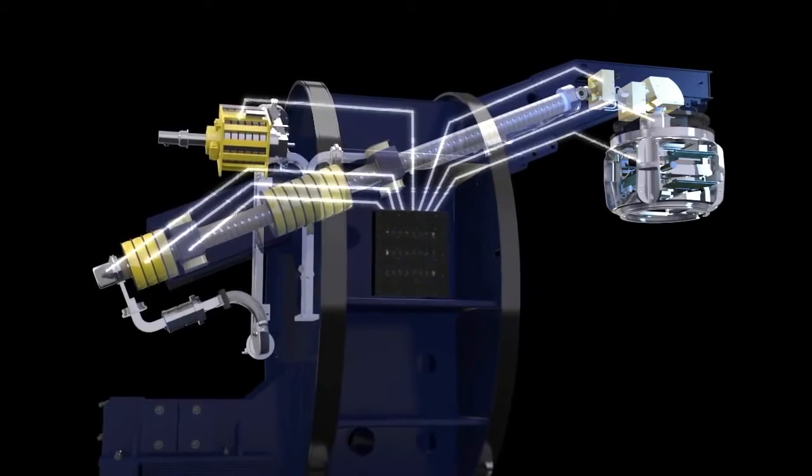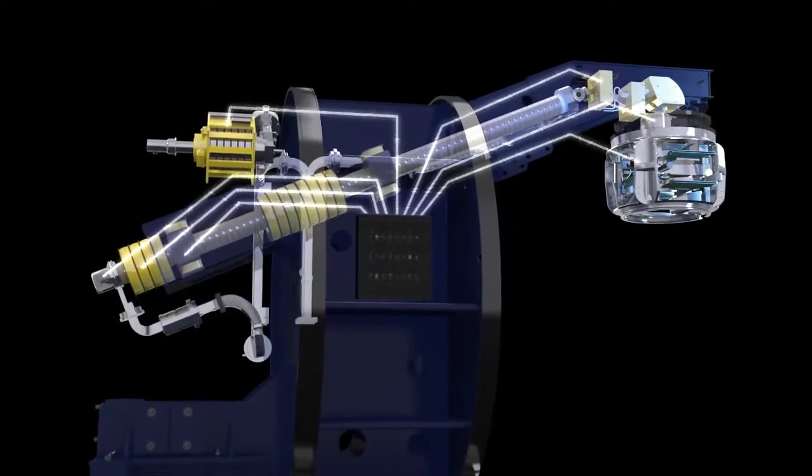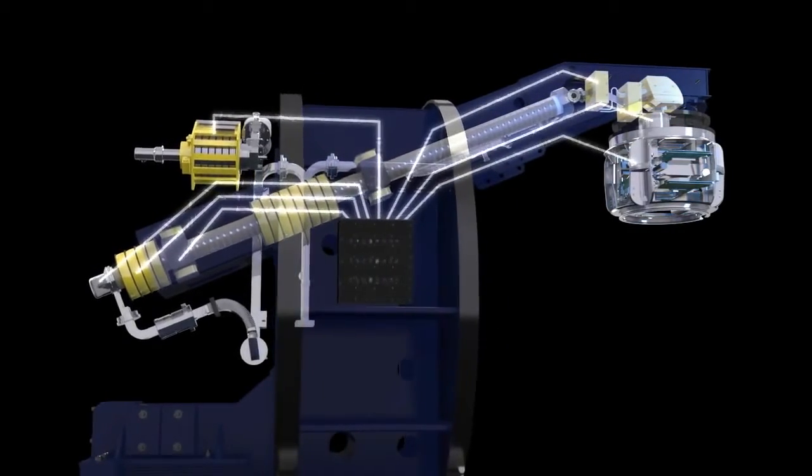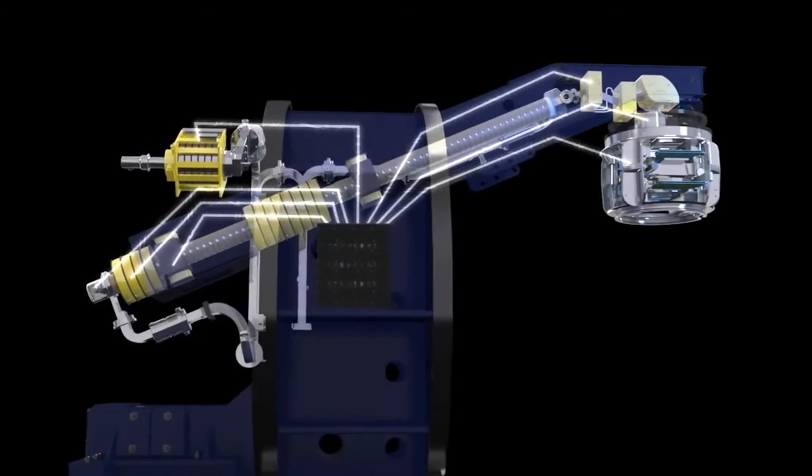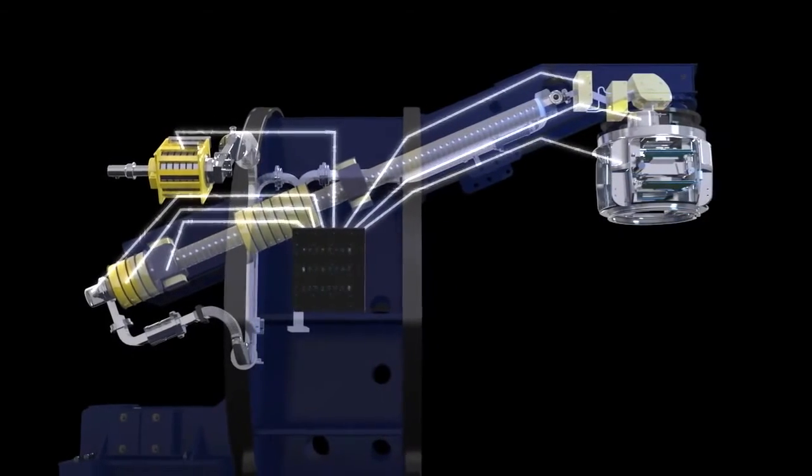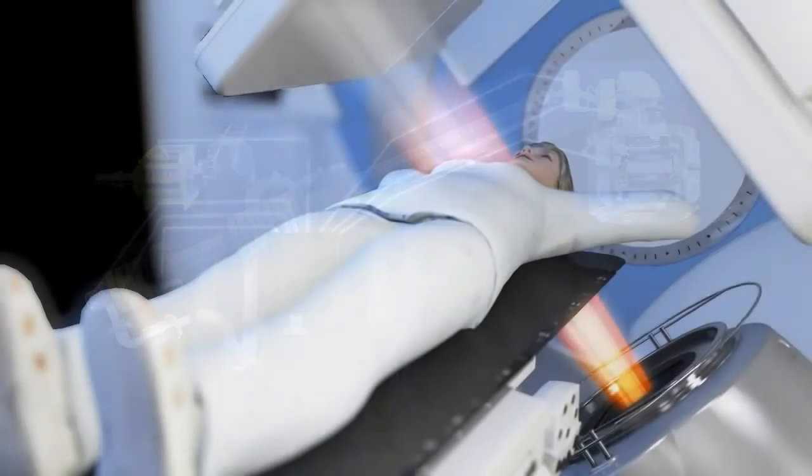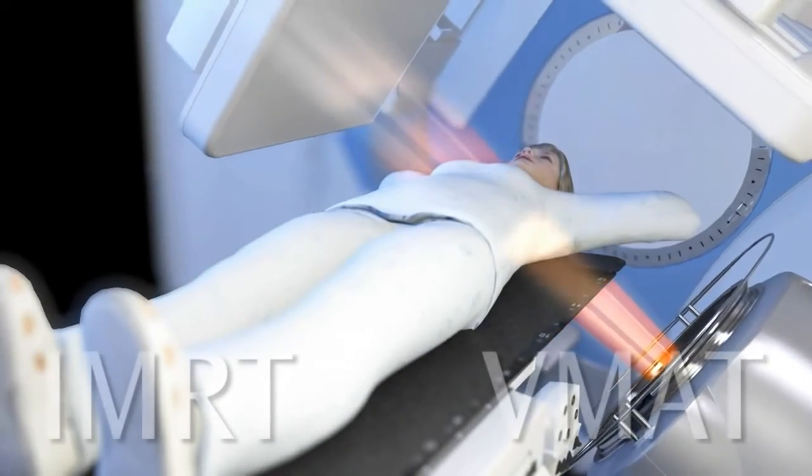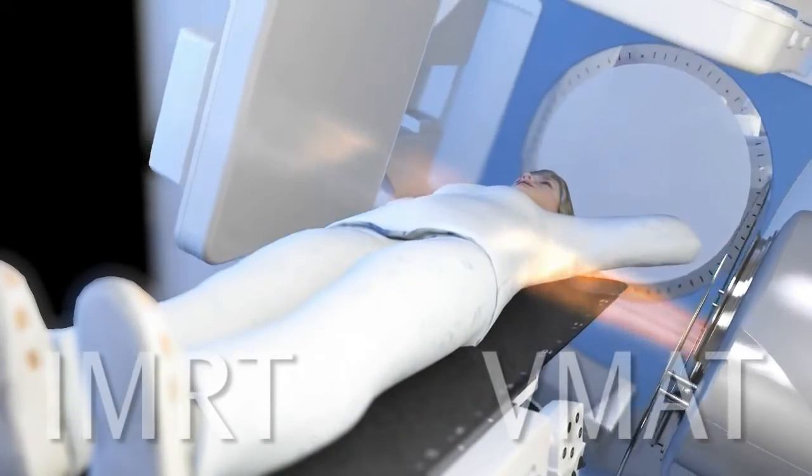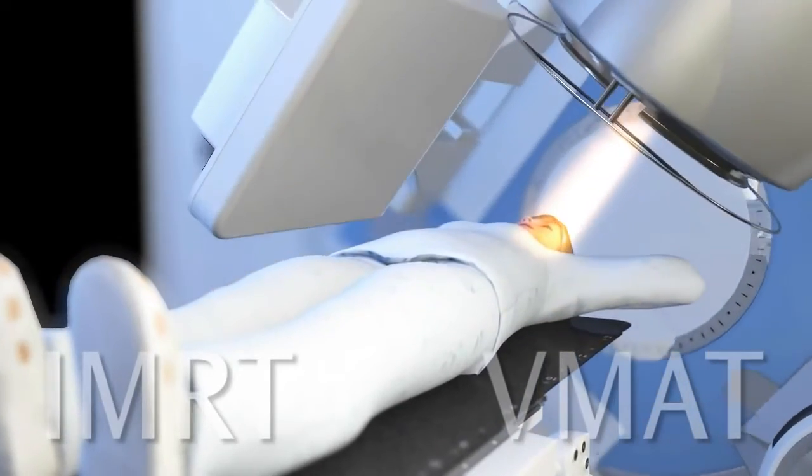This eliminates dosimetric errors due to communication delays. It also ensures synchronization between the delivered dose and the multi-leaf collimator position, allowing complex deliveries, such as intensity modulated radiation therapy and volumetric modulated arc therapy.